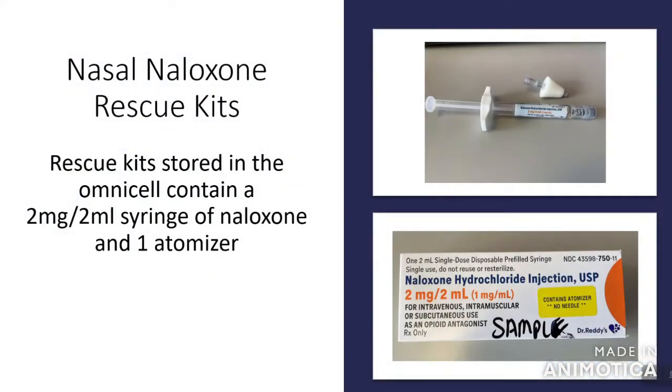Here at Salem Hospital, we now have nasal naloxone rescue kits stocked in every Omnicell. Each kit contains a 2 milligram per 2 ml syringe of naloxone and 1 atomizer, as shown in the pictures above.